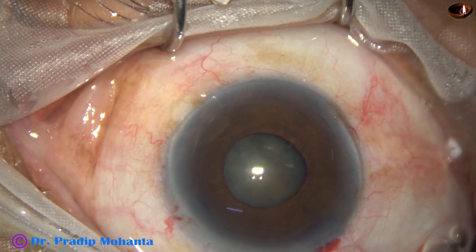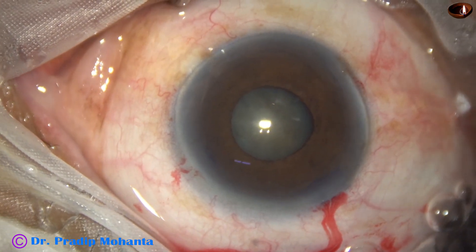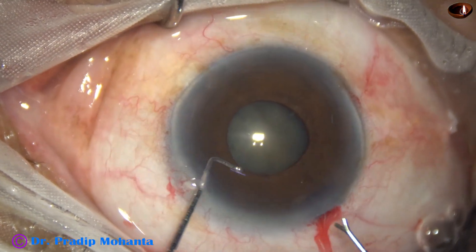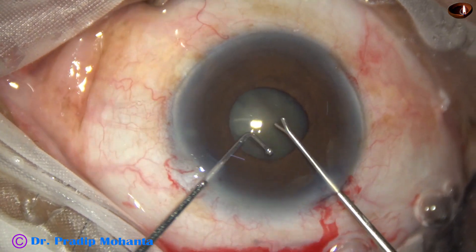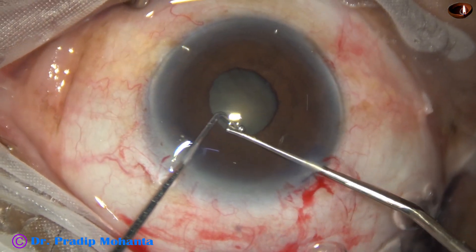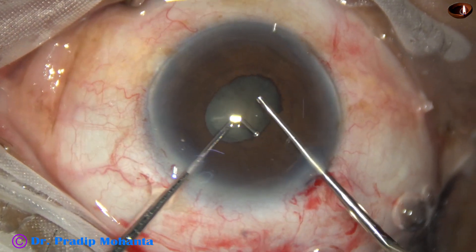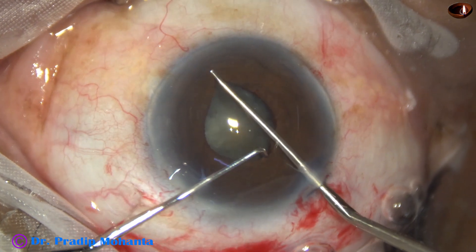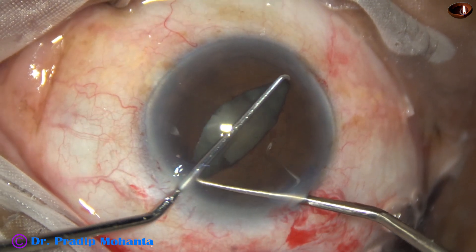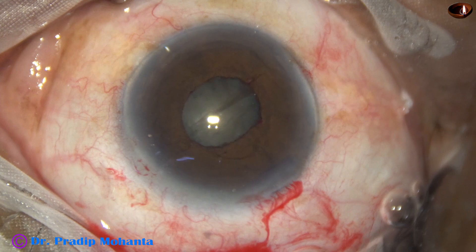In this case, I have decided to use a B-Hex, and before applying B-Hex I am doing controlled stress of the pupil. I wanted two Y-hooks but I did not get them, so with the help of a ball-tipped chopper and a Y-hook, I have stressed the pupil a bit.